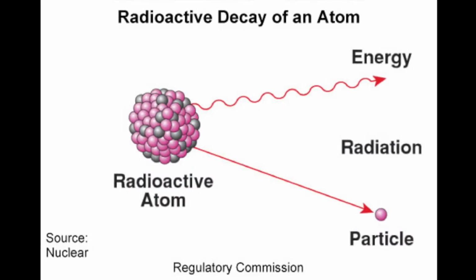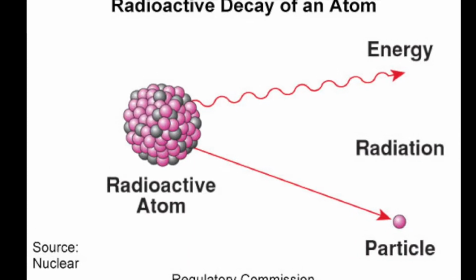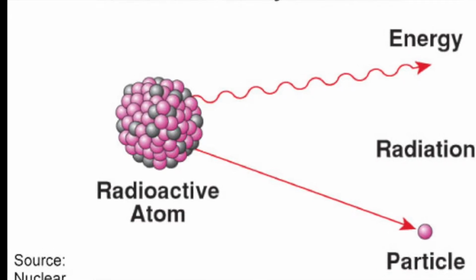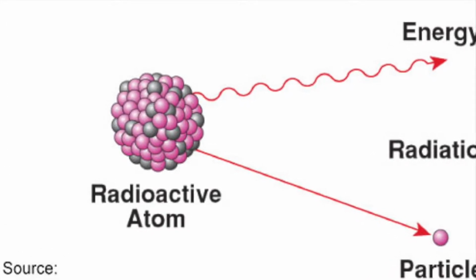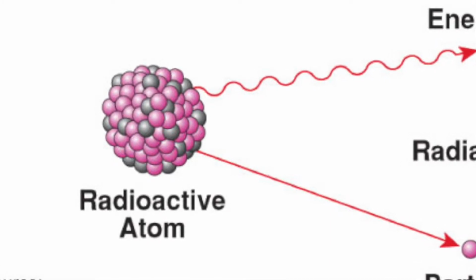The PET scanner is a scanning device that creates 3D images of organs within a person's body using radioactive tracers. These tracers are used to produce a radionuclide, an atom with excessive nuclear energy, by attaching radioactive atoms to a chemical substance used naturally by the organ or tissue being tested.